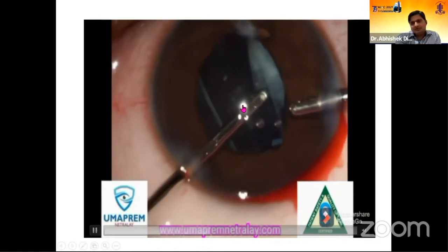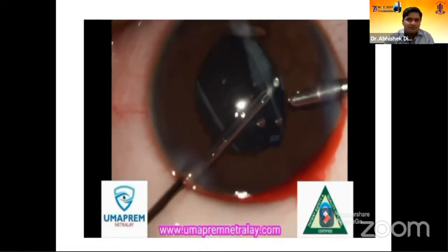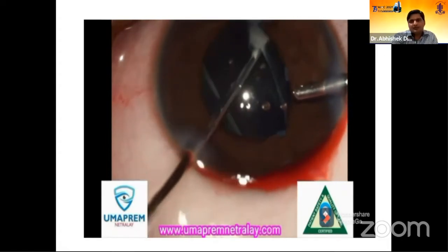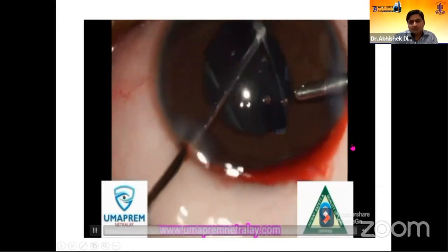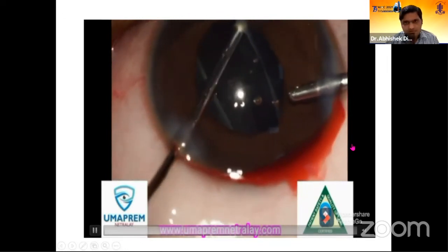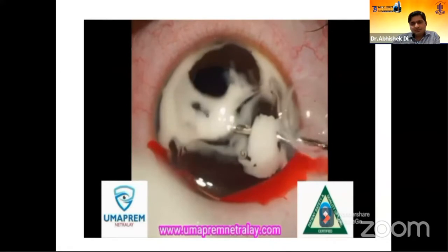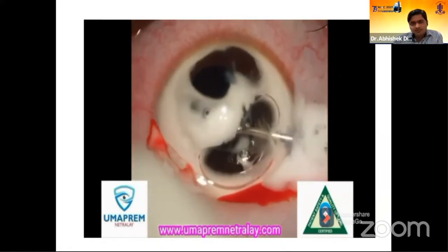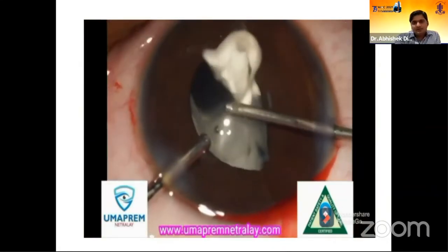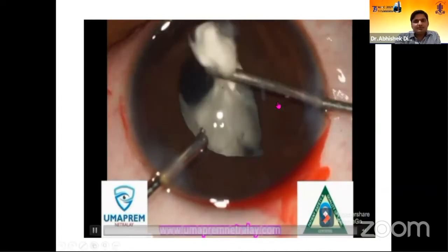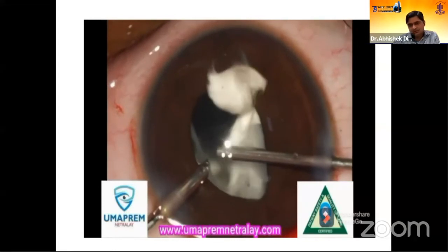We then noticed a posterior capsular tear was also present. After aspirating the lens without cutting, we stained the anterior chamber with triamcinolone acetonide. We placed an air bubble and injected it into the anterior chamber, then proceeded to cut the anterior vitreous in the chamber with a cutting rate around 300 and vacuum around 100.